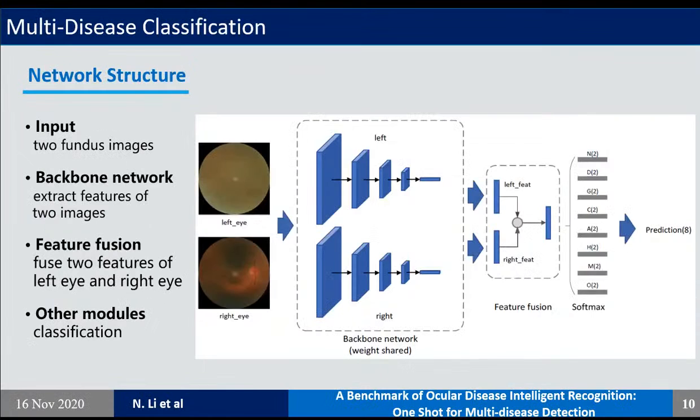In order to establish benchmark performance on our proposed OIA-ODIR dataset, we selected 9 currently popular deep convolutional neural networks to evaluate their performance on the dataset. The figures above show the details of our modified network. Firstly, different from traditional image datasets used for disease screening, the status of patients takes into account both left eyes and right eyes at the same time. Therefore, the inputs of the network are 2 fundus images and the corresponding ground truth.